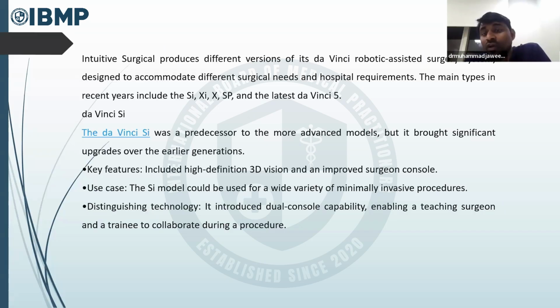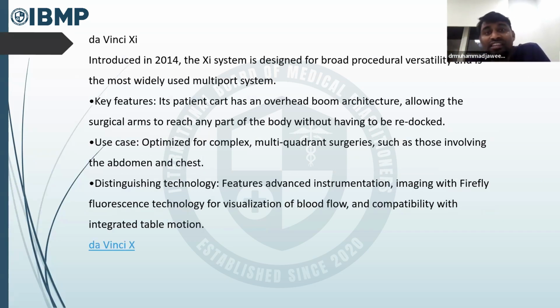Distinguishing technology, it introduced dual console capability. The dual console is nothing but two surgeons can operate on a single patient. It started from SI. Got it? So one surgeon can teach while one surgeon does the procedure. Da Vinci XI was introduced in 2014.